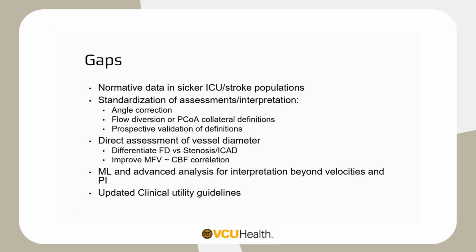I think there's a lot of information in the waveform that gets left behind when you reduce it to a handful of numbers. And then, given what we've all seen with the billing and scaled back reimbursements for TCDs, it would actually be helpful to have some updated guidelines for the clinical utility of TCD in various clinical settings. And I think the applications for TCDs should be growing, not shrinking. And I think the societies have a role to play in advocating for that.